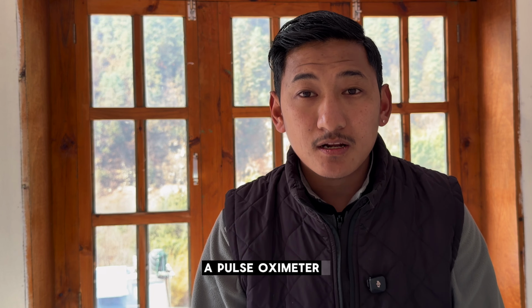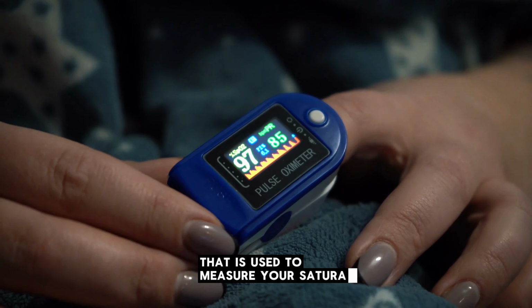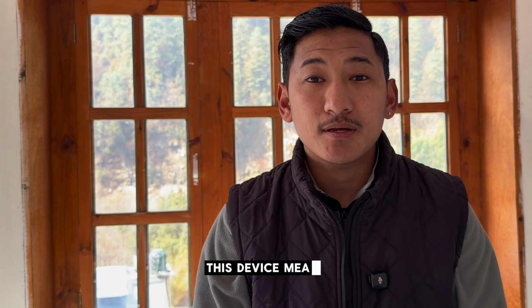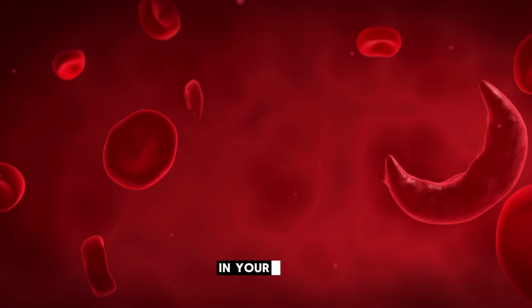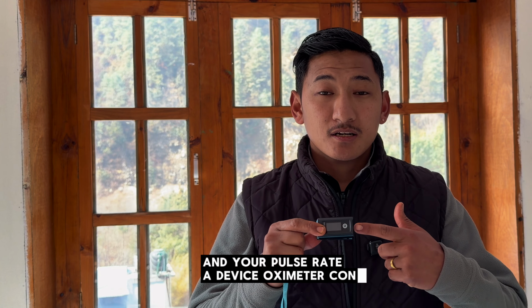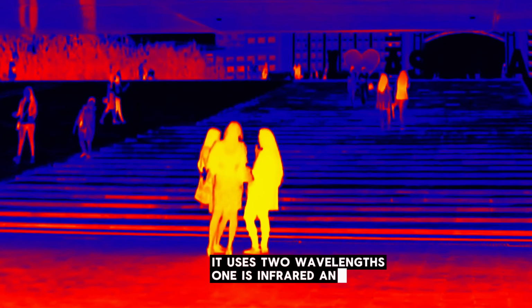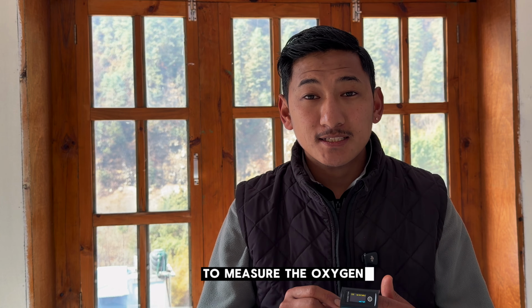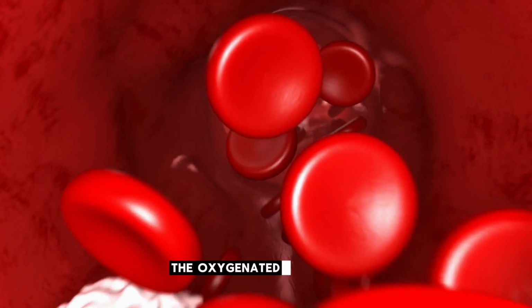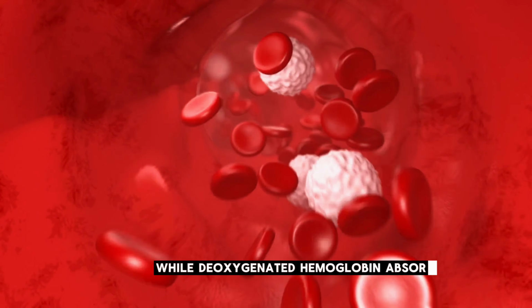A pulse oximeter, or often called just oximeter, is a device that is used to measure the saturation of oxygen in your blood, which is also referred to as SpO₂. This device measures the percentage of hemoglobin in your arterial blood carrying oxygen, and your pulse rate. The oximeter connects on your fingertip. It uses two wavelengths, one infrared and one red, to measure the oxygenated versus deoxygenated blood in your blood vessels. The oxygenated hemoglobin absorbs more infrared light, while deoxygenated hemoglobin absorbs more red light.